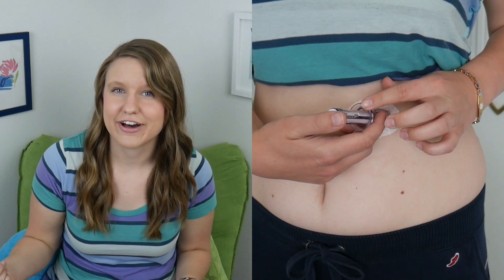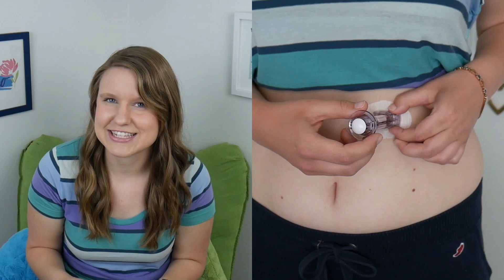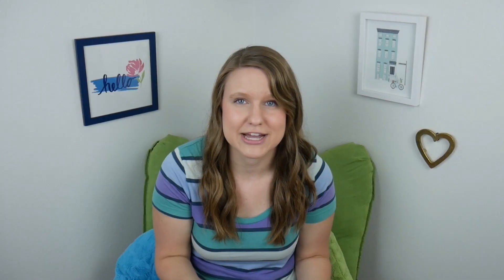Next, you want to pull up on the collar to take the needle out. Pull up until you hear two clicks or can't pull back anymore. This will leave the sensor inside. Now, you are going to squeeze the sides of the applicator — there are little buttons on the side — and rock the applicator forward so that it pops out.